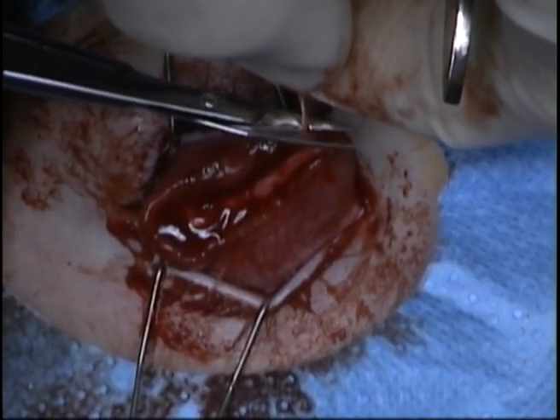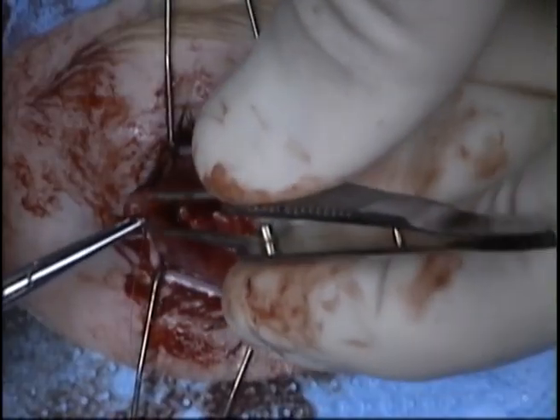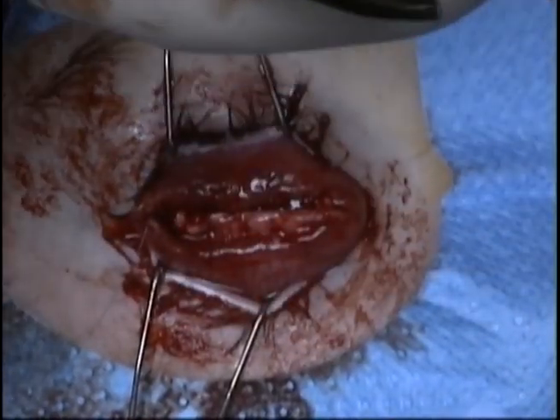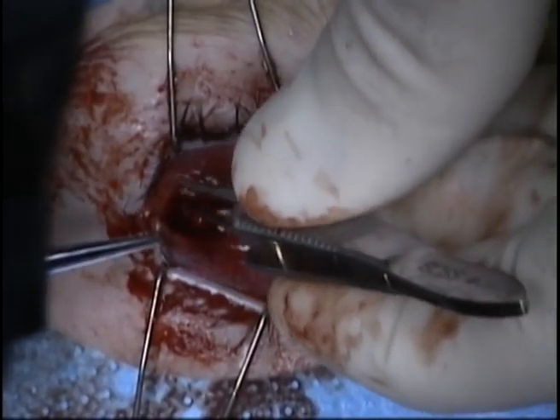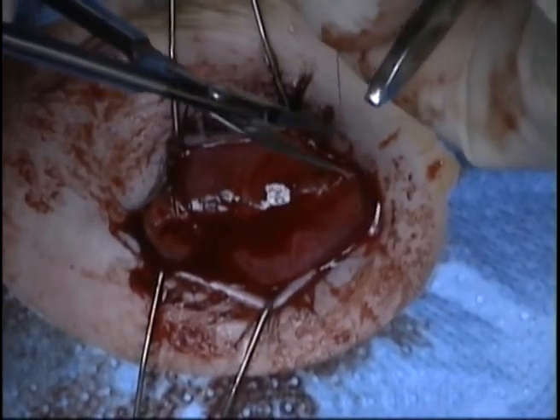The conjunctiva is then closed over the sclera to provide a third layer over the implant. I do feel that the closure of Tenon's is not necessary, as you already have two layers of sclera and a layer of conjunctiva.